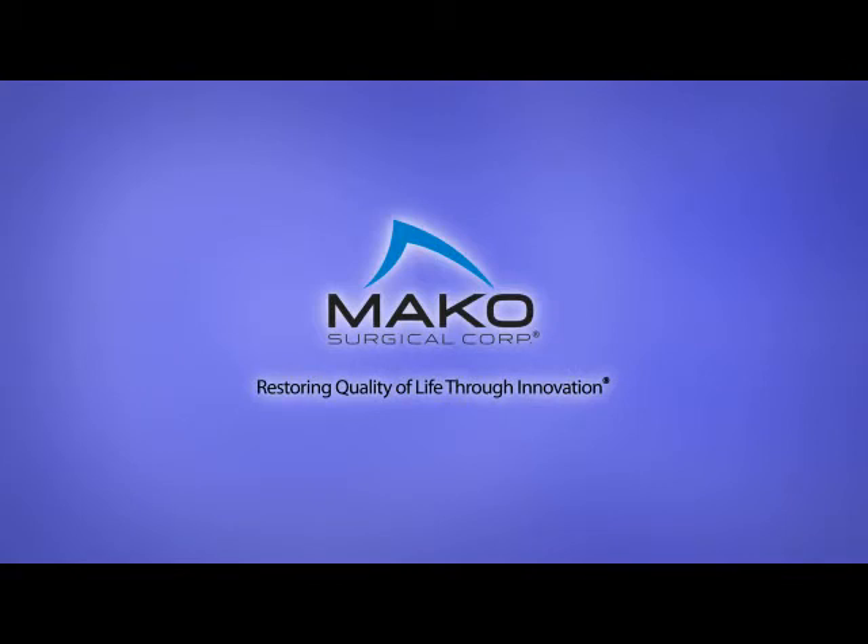Makoplasty Hip, providing a new level of accuracy and precision to total hip arthroplasty.